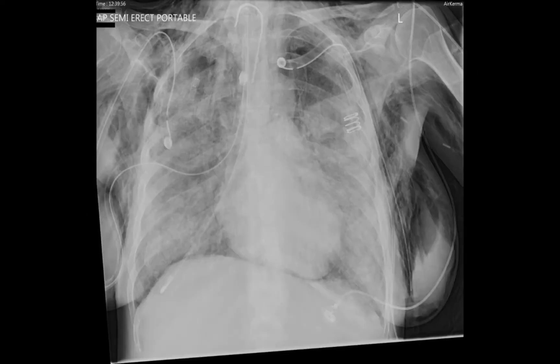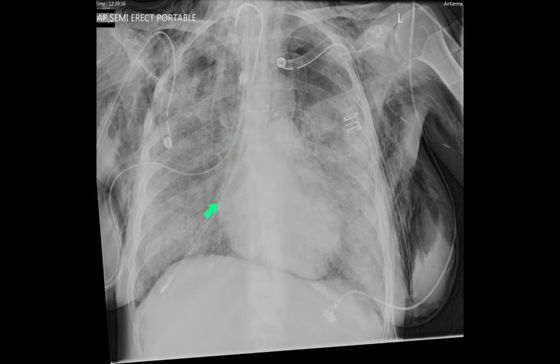Here's another patient who has the continuous diaphragm sign. They are intubated, there's a tracheostomy, and note also there's an NG tube which is in the right lower lobe bronchus — so that is misplaced. They have two intercostal drains on the right, one on the left, and a good deal of surgical emphysema.